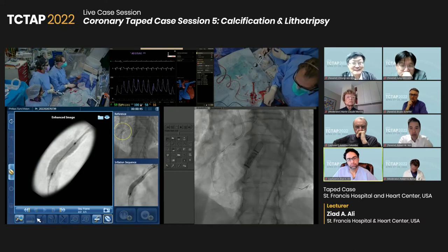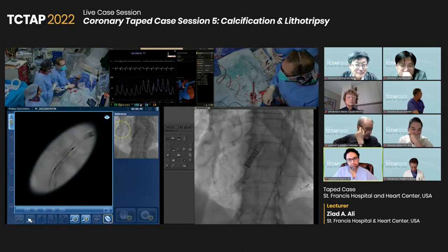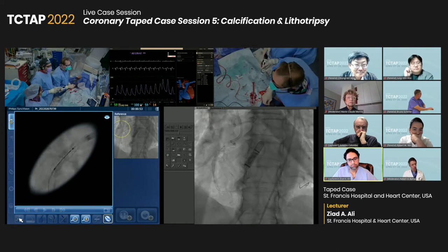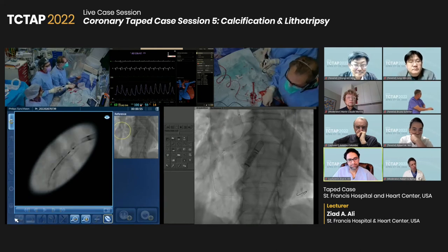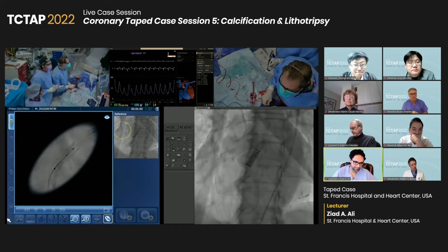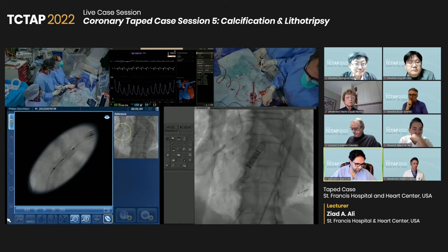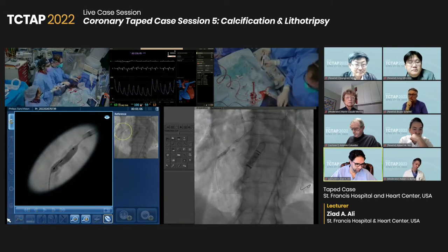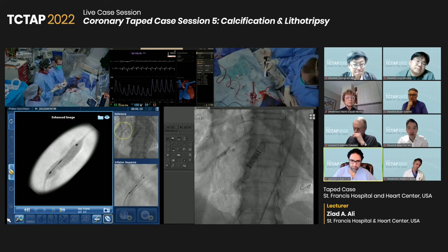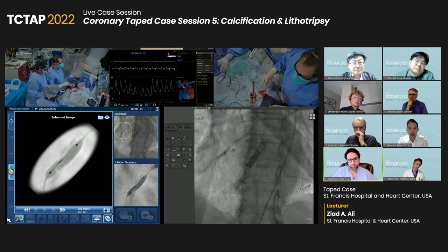22.48. Honestly, you got to love technology. We've got device detection on this side. We're shock waving. I did atherectomy. I don't think anybody likes technology as much as you do. I really do like it. I gotta say, like a teenage kid. All right, I think this is good. Going up. 22. We'll do the OCT next. 22.48. Watch your distal wire.